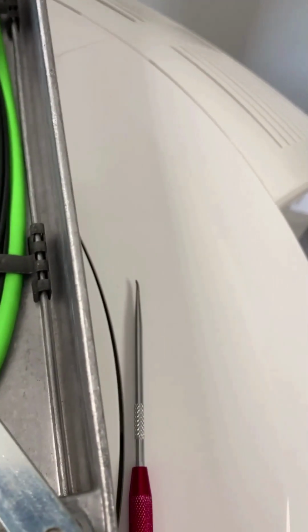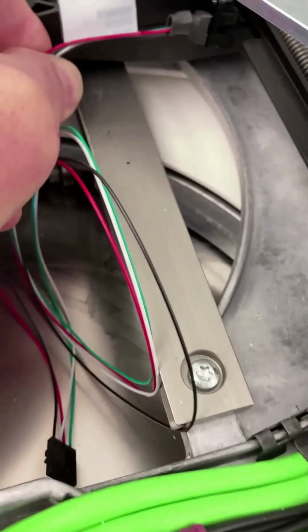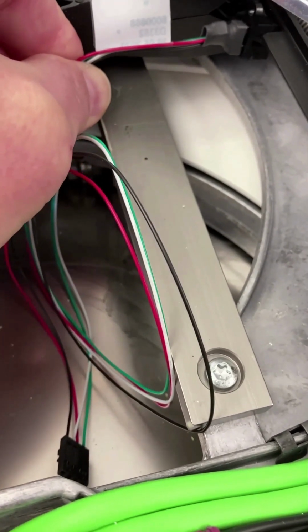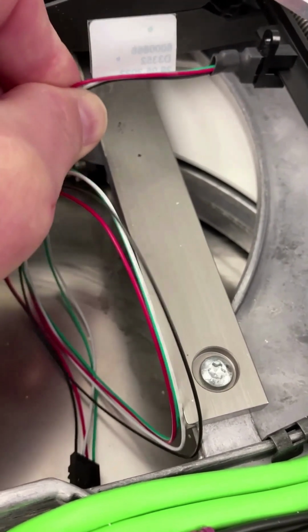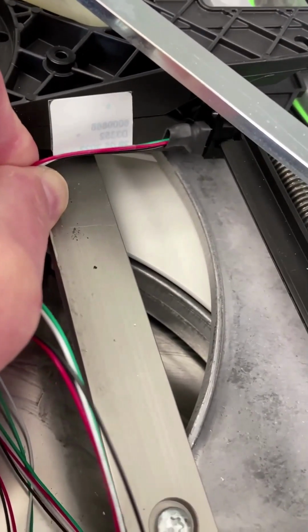Think of the light barrier as a limit switch. As it travels along the rail and the light is open or closed, the software knows at what position the linear movement is at its start and stop positions. There's the example of the barrier traveling on the rail.